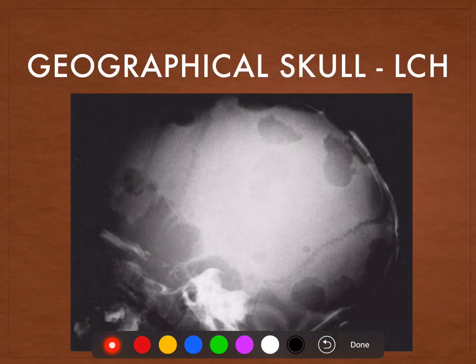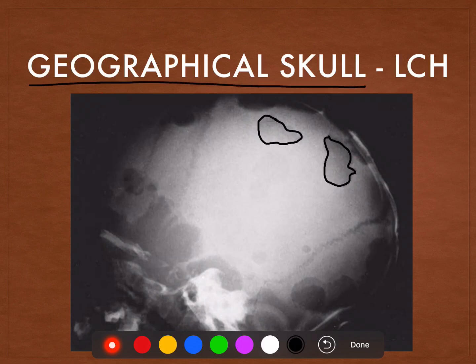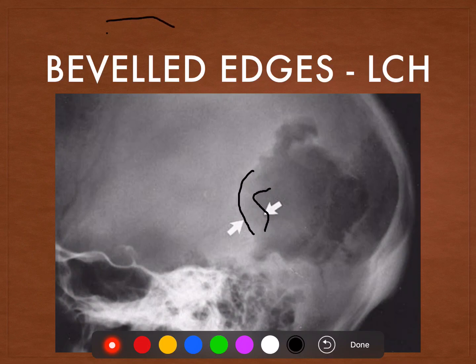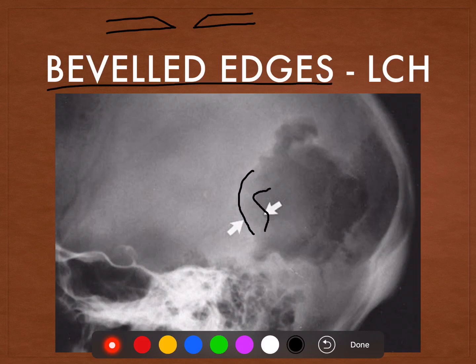In the next image, we see these well-defined lytic lesions seen in the skull of a young patient, and these lesions look like that somebody has drawn a map on the skull. This skull is known as the geographical skull and it is characteristic for Langerhans cell histiocytosis. If you zoom in on one of these lesions, we see two edges — this is because of the beveled edge, meaning there is unequal involvement of the outer and the inner table of the skull. This beveled edge appearance is again characteristic of Langerhans cell histiocytosis.